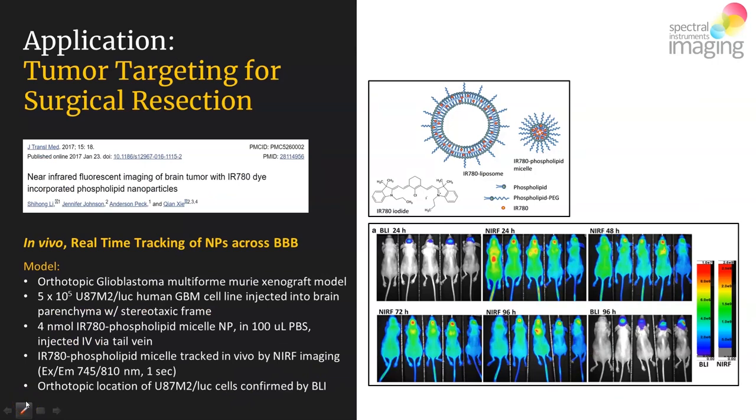Now, the interesting aspect of this next study is that the investigators structured their experiment to assess the possibility of conducting the following clinical protocol. Would it be possible to label a glioblastoma tumor mass with a fluorophore reporter such that at the time of surgery, at the surgical site, the surgeon could use an excitation light to light up the glioblastoma tumor mass, courtesy of the fluorophore reporter that was directly bound to it?